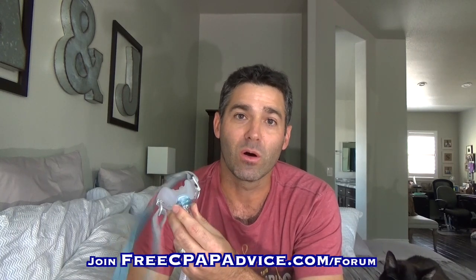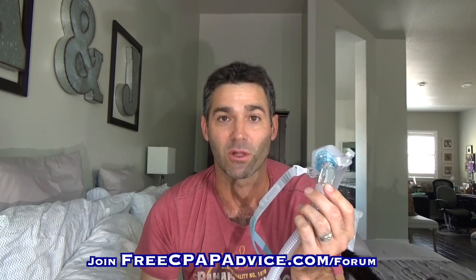So that's pretty much it. If you have any comments or questions on the Fisher Paykel Brevita, let me know in the comment section. If you have a differing opinion, let me know below. This thing might be a good mask, especially considering Fisher Paykel always seems to have a lower price point than other manufacturers. If you're paying out of pocket, it might be a good option for you. Overall though, I wasn't entirely impressed by it.